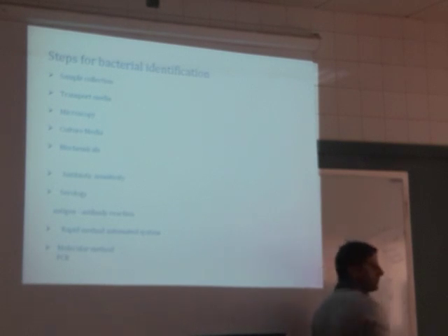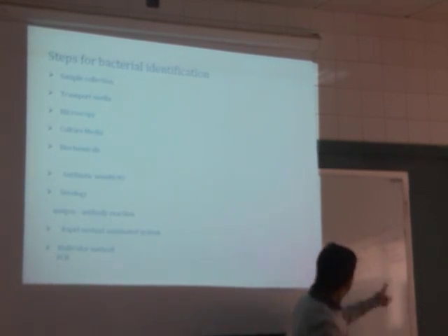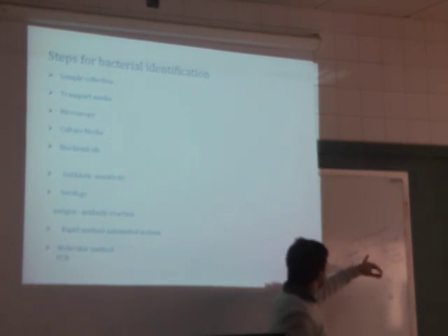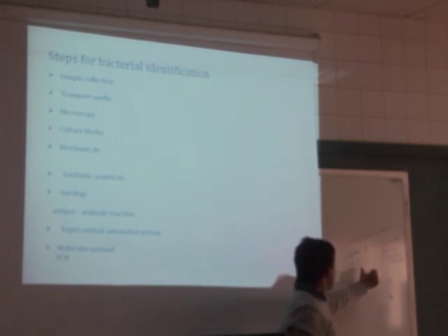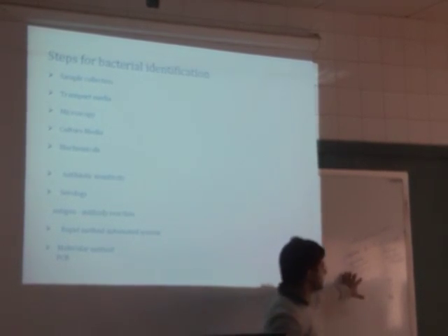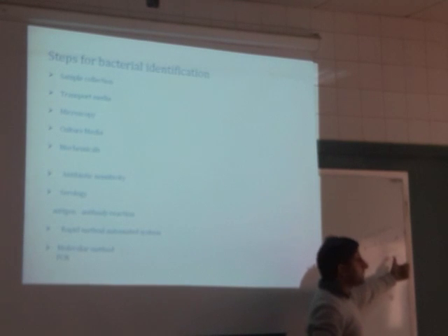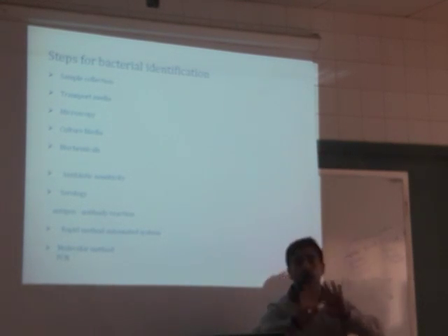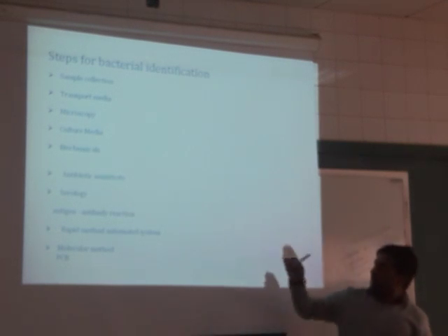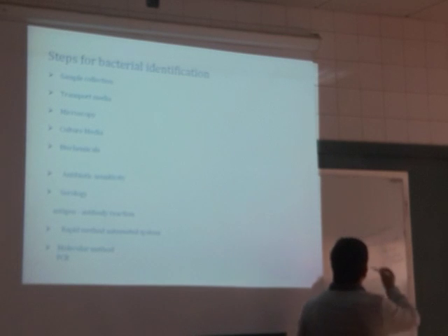Oxidase, one more enzyme in the bacteria. Coagulase, one more enzyme. It is not necessary that all three are present in one microbe. Some microbes have the coagulase enzyme. Some microbes have the catalase enzyme. Some microbes have tryptophanase. Some have oxidase. So it is not important; it depends upon the pathogenic bacteria which type of enzyme is present. Similarly, it is not necessary that all bacteria can use the sugar. They can use different types of sugars.